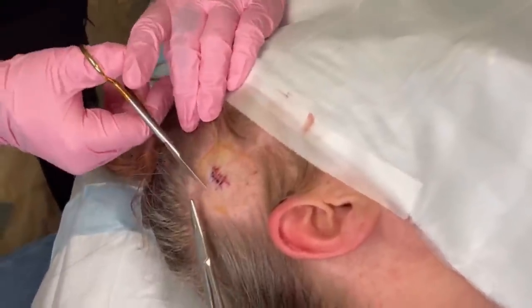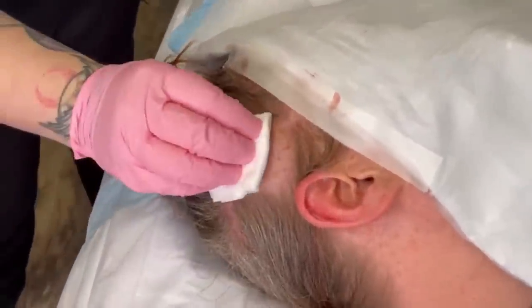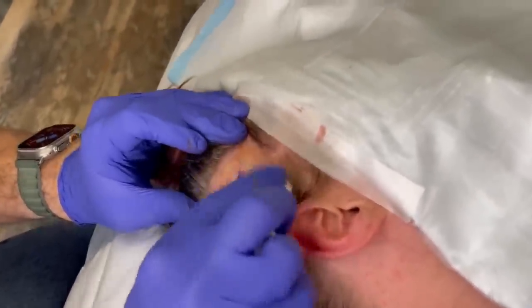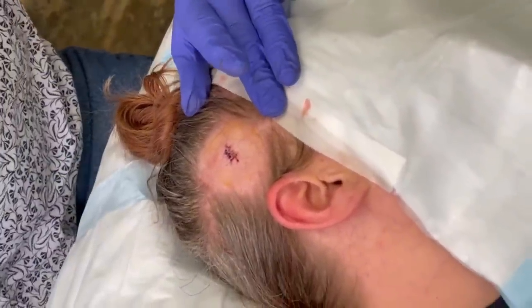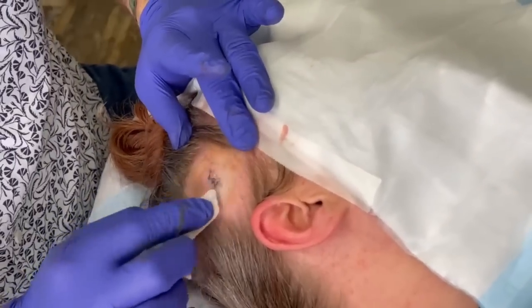Thank you. Okay, now we are done. Really, for reals. So five stitches on the side? Yeah. Cool. High five to everybody for that one. That feels really good. I don't need flush. I'm so excited. Don't need flush, but a little bit of peroxide just to kind of clean. On the tip? Yeah, let's just do that. There we go.